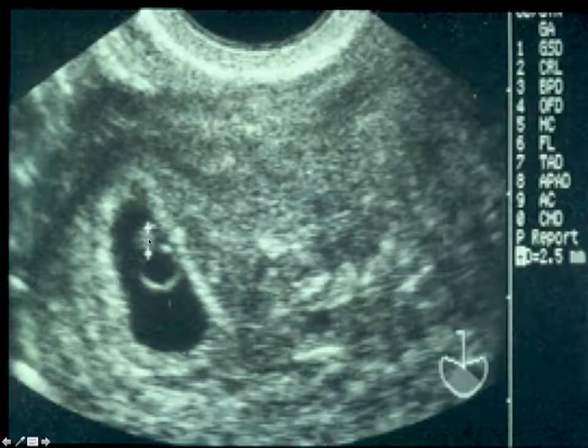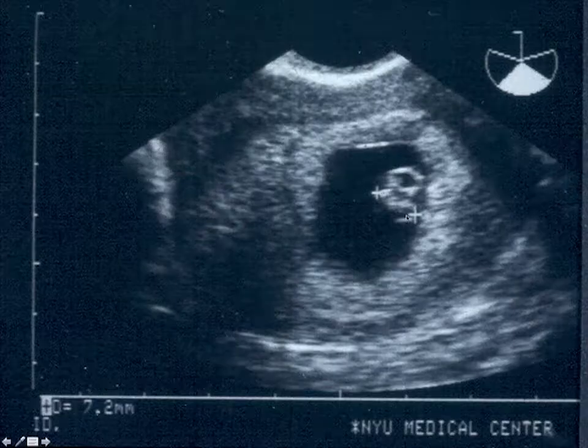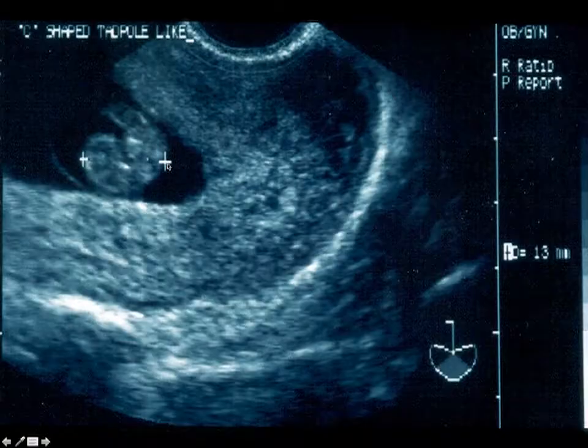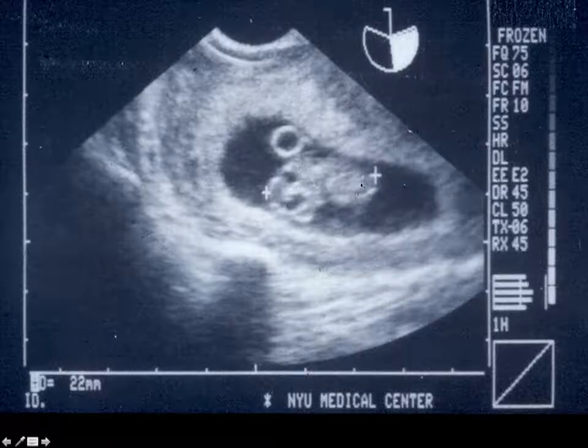And so here's a 3 millimeter embryo at 45 days. Here's a 5 millimeter embryo at 47 days from the last menstrual period. Here's a 7 millimeter embryo at 49 days. Here's an 11 millimeter embryo at 53 days. Here's a 13-millimeter embryo, C-shaped tadpole-like structure at 55 days LMP, and at 22 millimeters, which is now 9 weeks and 1 day.